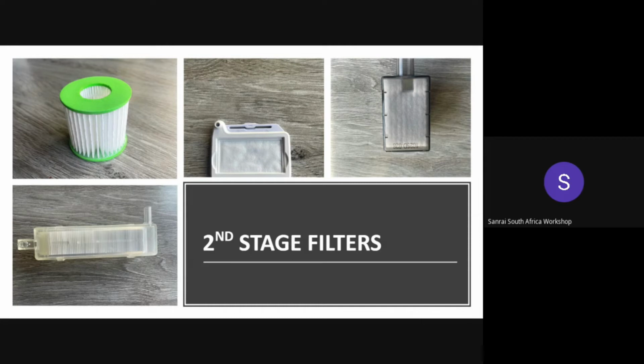And also, the machine should not be modified in order to fit in a HEPA filter that might look like the original HEPA filter of that machine. The paper filter found in the OxyFlow looks like an oil filter. These oil filters should not be used in OxyFlow machines.